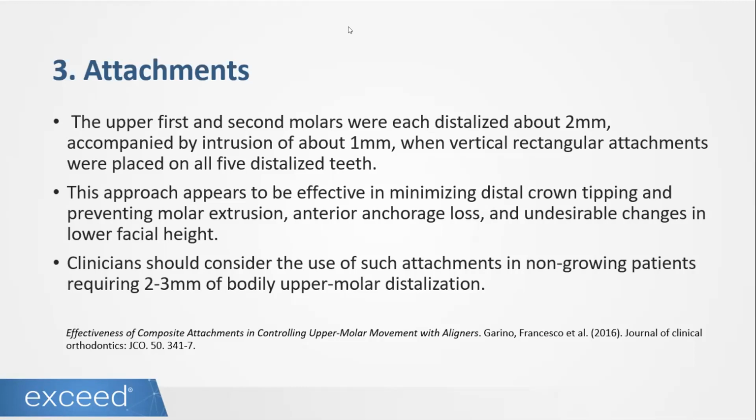or angulations. If you have a patient that maybe doesn't want attachments, maybe they work in TV or in cinema, or I don't know, they work out in the public, note that if you don't use attachments, then you are going to get more tipping than root movement. But you can also go and add an attachment on the lingual or palatal surface. And this is something that you can do. The movement is not going to be the same.